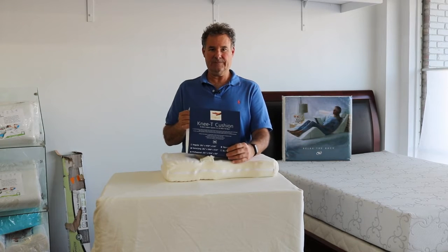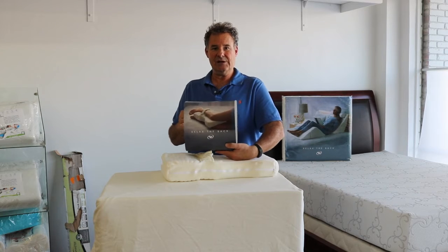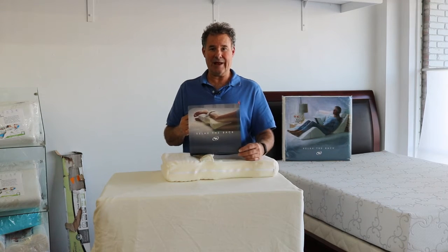Today we're here to talk about the Knee T. This is the retail packaging that you would find for the Knee T in a retail store. This particular one comes from Relax the Back.